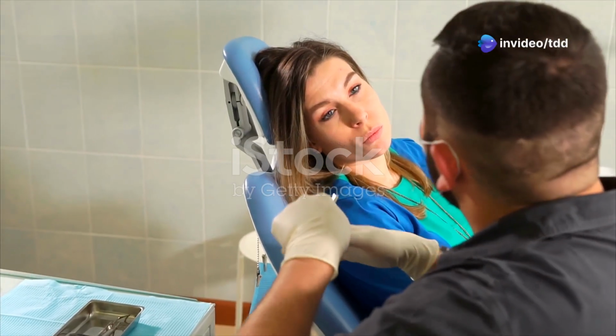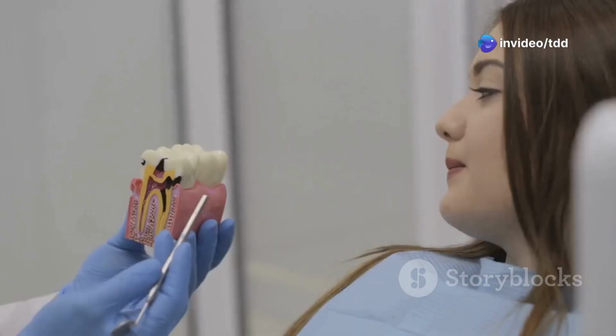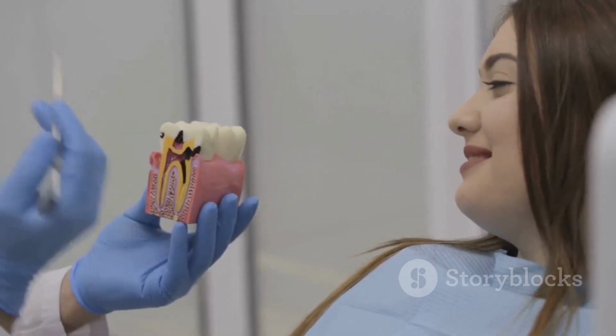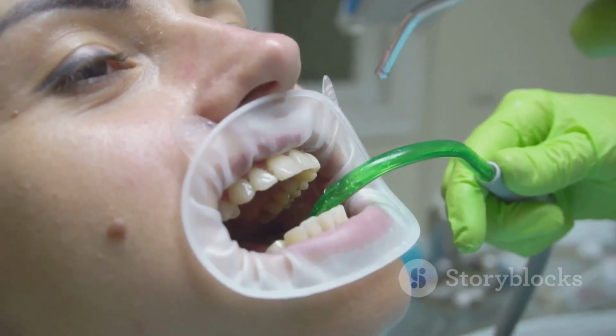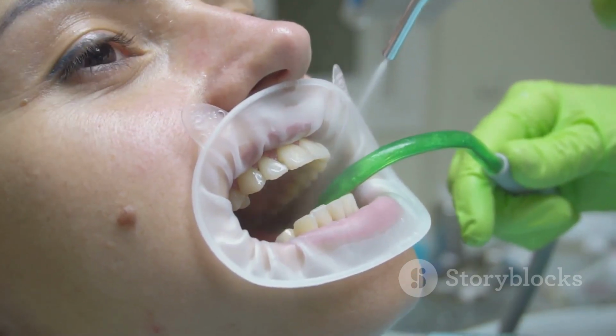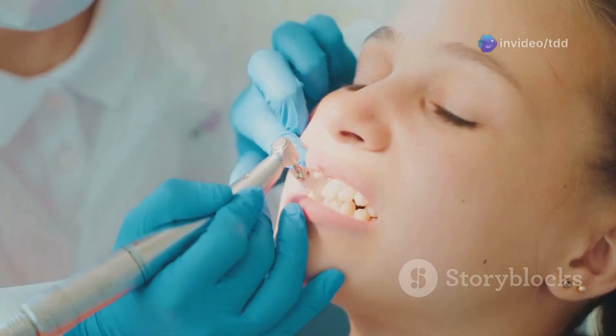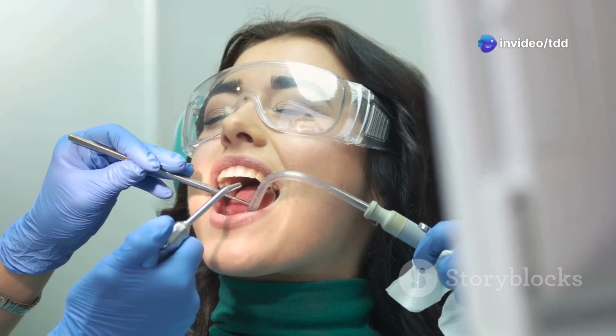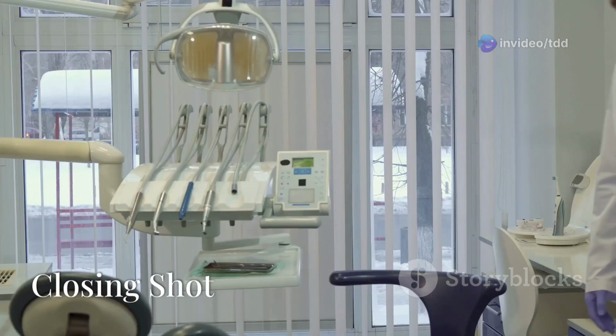Here are some quick tips for administering anesthesia in the maxilla. First, use the mucobuccal fold as your primary landmark for infiltration and nerve blocks. Second, aspiration is key to avoiding intravascular injection. Third, inject slowly to reduce patient discomfort, and don't forget to check for numbness before proceeding with any procedure.